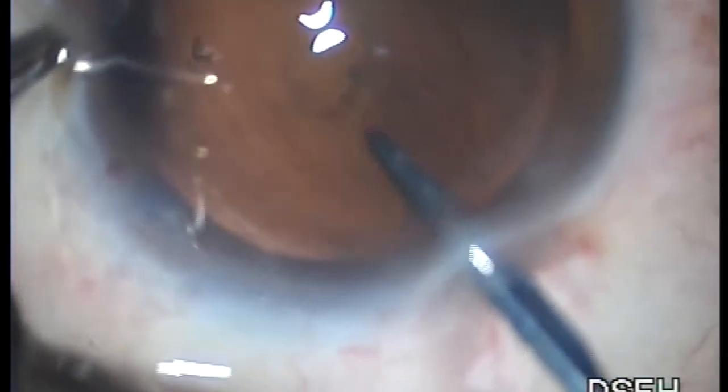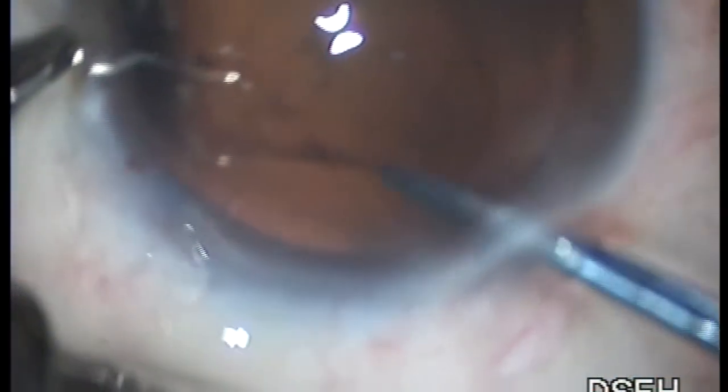Now extending from this side to the other side, a double oval capsulotomy has been produced.